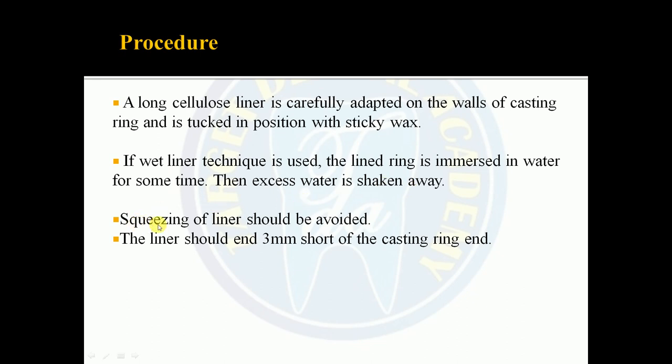You are not going to squeeze the liner. Squeezing of the liner should be avoided. The liner should end 3 mm short of the casting ring. It is a very important point.